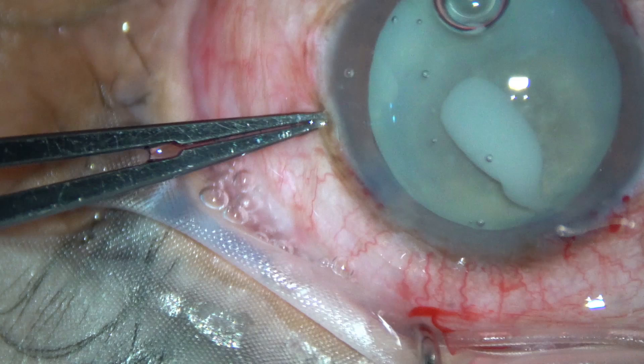Friends, this is a hypermature Morgagnian cataract. Let us observe this surgery.